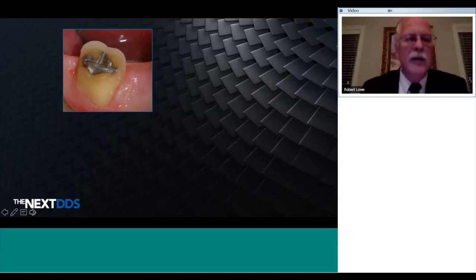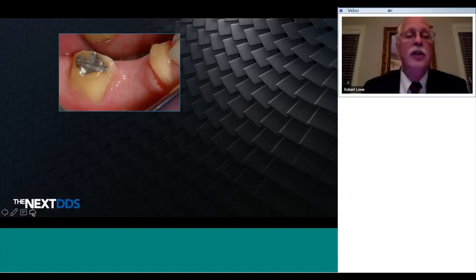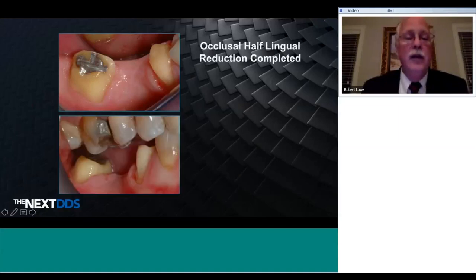Prepping like Abe Lincoln's top hat leaves crowns that have too wide of occlusal tables, too broad of contacts, non-anatomic, and too much function, and hard, impossible to clean. Do the same thing then on the lingual. Occlusal half, gingival half. Then look at opposing.